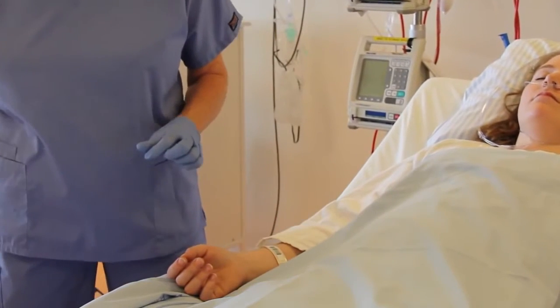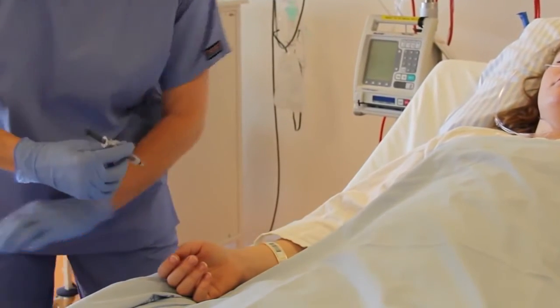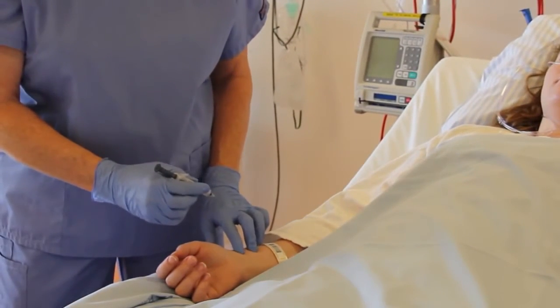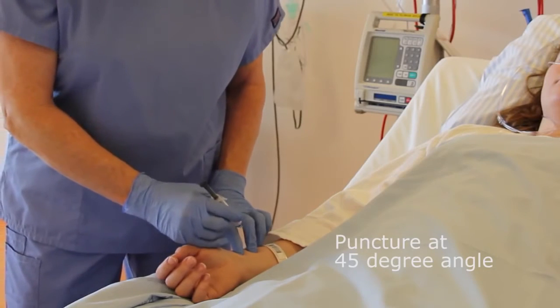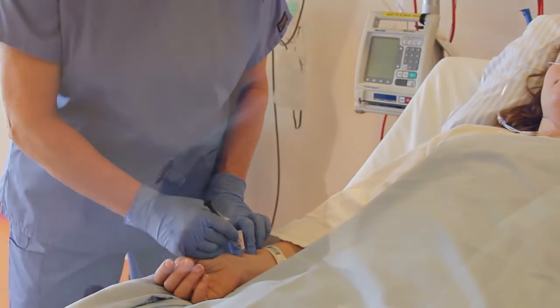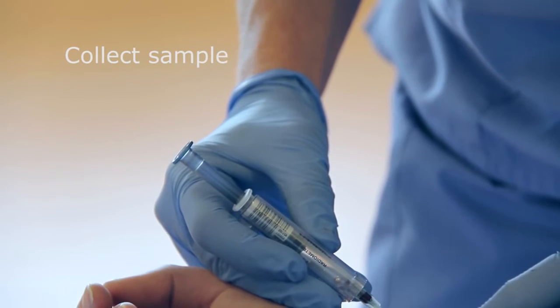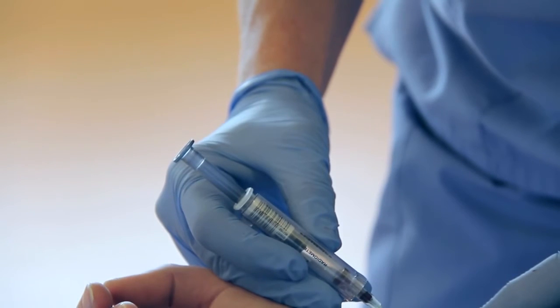For self-filling syringes, preset the plunger to the recommended volume. Hold the needle bevel at a 45 degree angle or less to minimize trauma to the artery and puncture the skin and arterial wall. Hold this position until you have collected the desired blood volume.